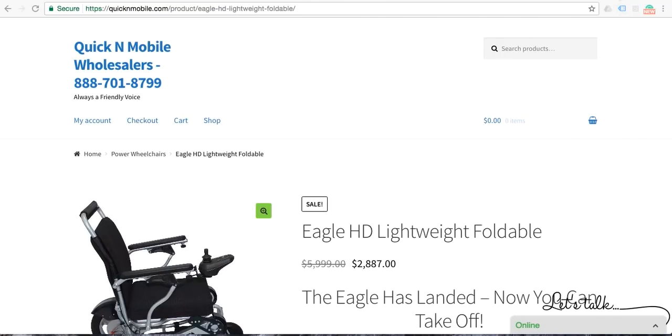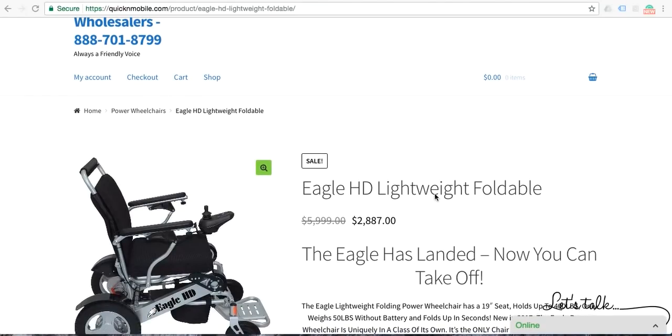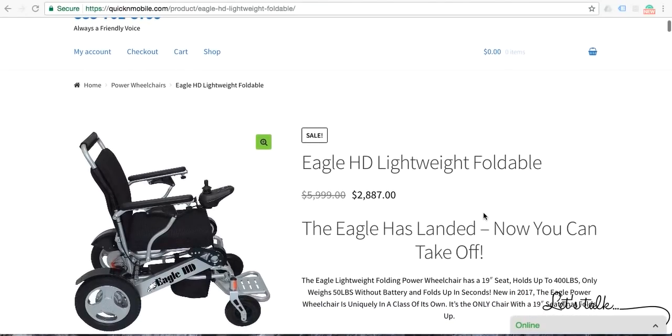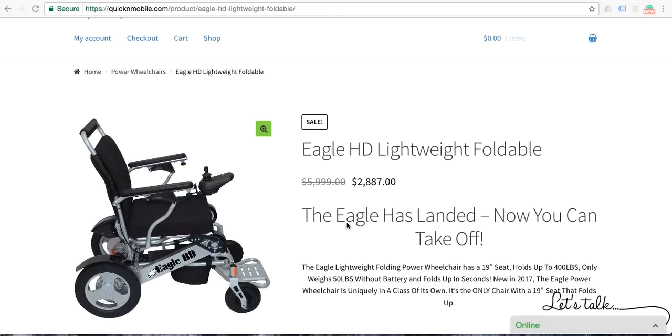In this review, we are going to be going over our brand new power folding wheelchair, the Eagle. The Eagle has been designed fresh for 2017 with various features that we will go over in this particular review. The title: The Eagle Has Landed, Now You Can Take Off.